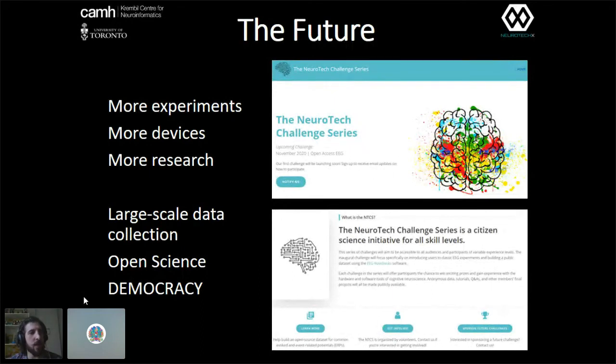that we're not going around with our laptop and our Muse EEG and handing it to people and getting them to sit down for an hour in a room in a library, whatever. We want people to do it in their homes with their devices on their laptops, with us not having anything to do with them.